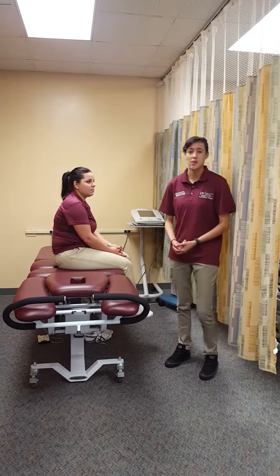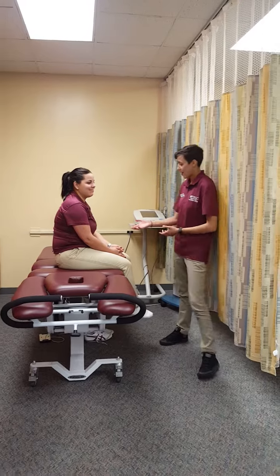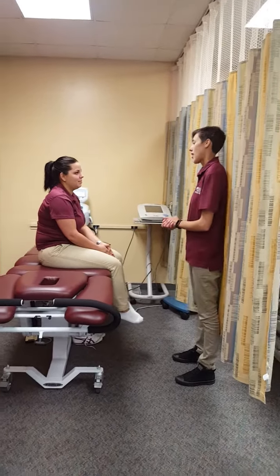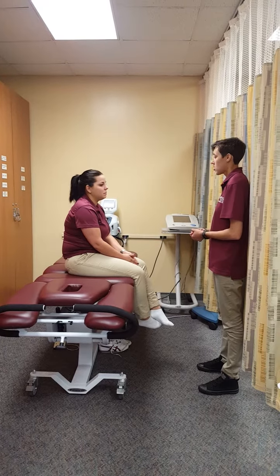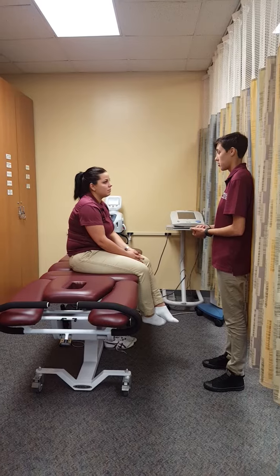This is my classmate and patient for the day, UC. Hello UC, how are you feeling today? Awesome. So I know you have a herniated disc in your cervical area and it's giving you some pain. So what we're going to do today is apply some cervical traction to help relieve that.